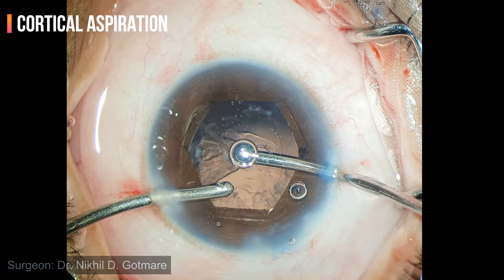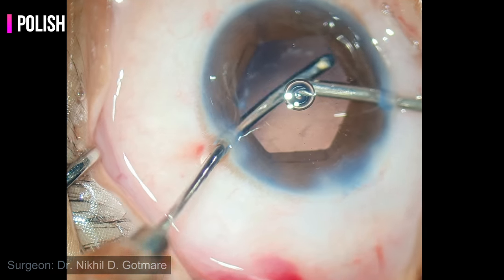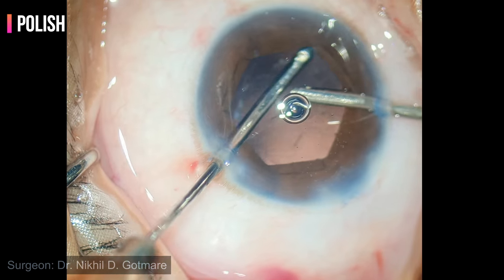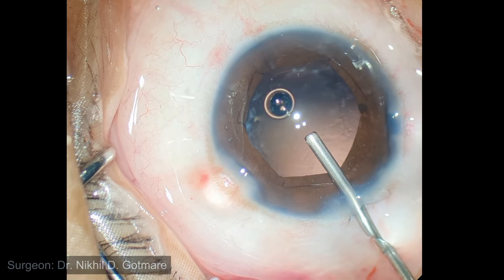There is not much cortical matter left behind as this was a total cataract. Complete cortical cleanup is important to avoid post-operative inflammation and PCO formation. However, in uveitic cataracts, some posterior capsular plaques may be present which refuse to come out.